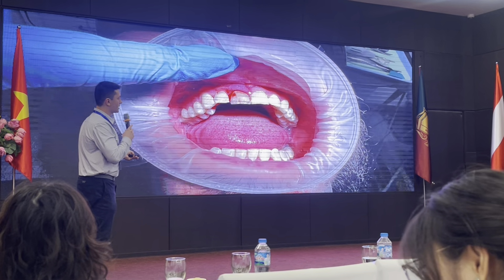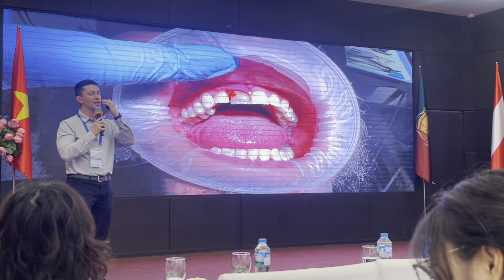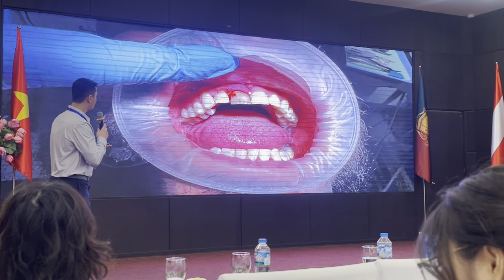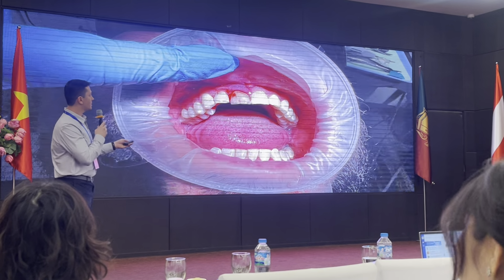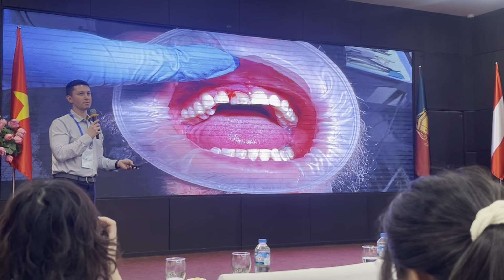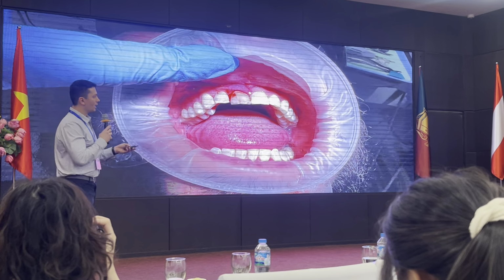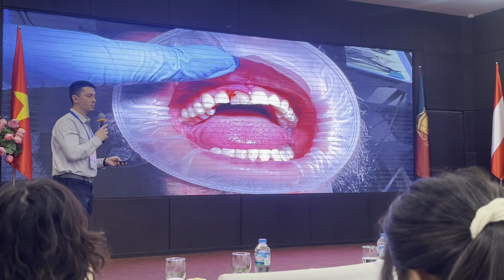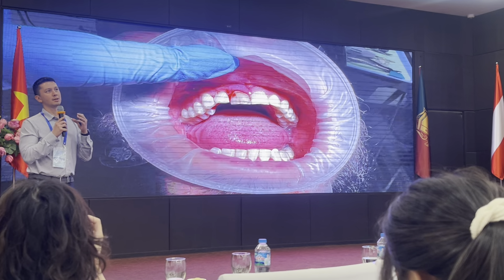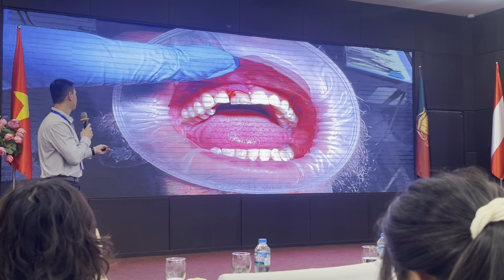I notice some of my patients have a lot of facial hair, like a thick mustache right here, and sometimes that hair can block the view of what you're trying to work on, which is this front tooth. Sometimes, honestly, it's not very hygienic. So this is what we call an Optragate, which is a fantastic disposable piece of material that helps us see where we're working and keep the lips out of the way. It creates almost like a softer bite block where they can have something to rest their jaw on and not have to strain their jaw muscles to stay open, because sometimes these are long procedures.